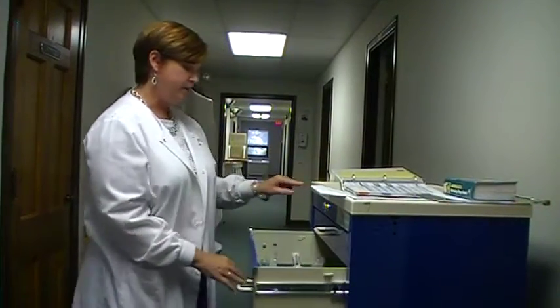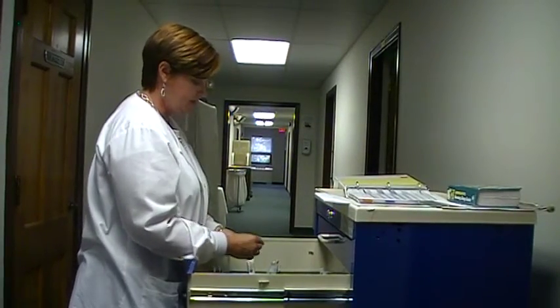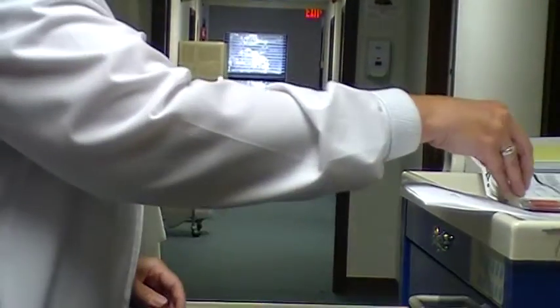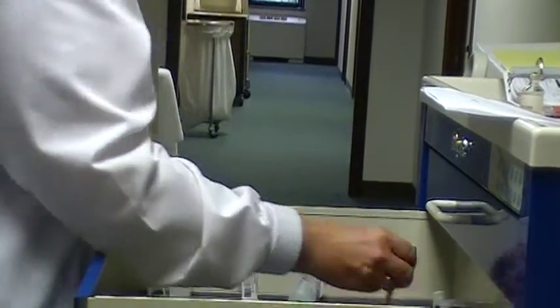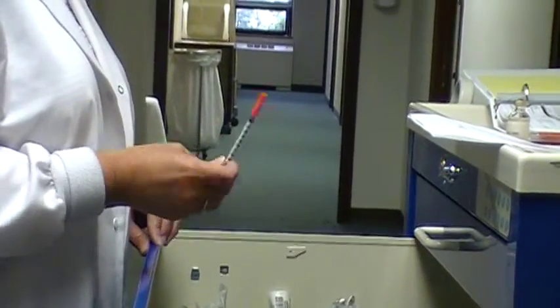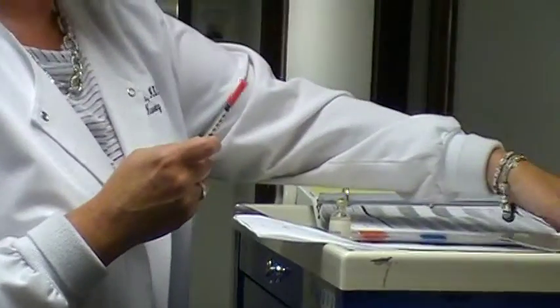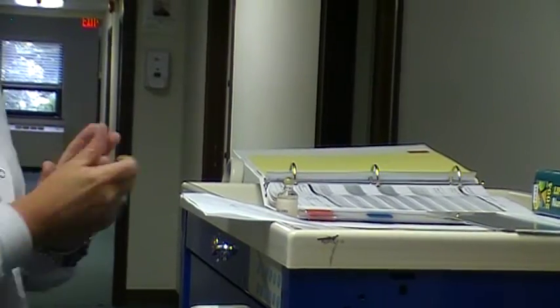Next I'm going to grab my medication — I'm giving Humulin N. I have to do my three checks just like with any medication. The first check is when I pull it from the cart, and I'm also checking the expiration date. The next thing is gathering other supplies, which includes an insulin syringe because I'm giving insulin, and my alcohol preps. I'm going to wash my hands prior to drawing up the medication.